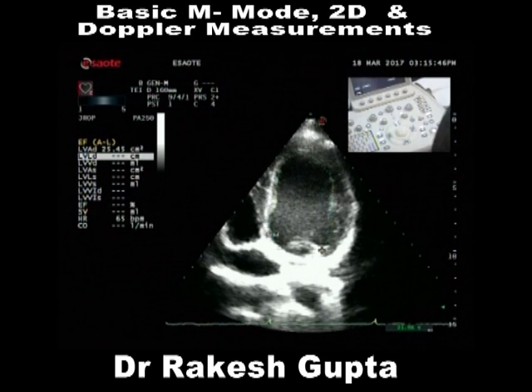So it gave you what? LV area during diastole. Now it's asking you dimension, length. So center of this point, enter and go to the apex. So it gave you an LV volume during diastole. It's not LVWD, it's LVVD. LV volume during diastole. So this is 81 mL. Now I am scrolling with the scroll.